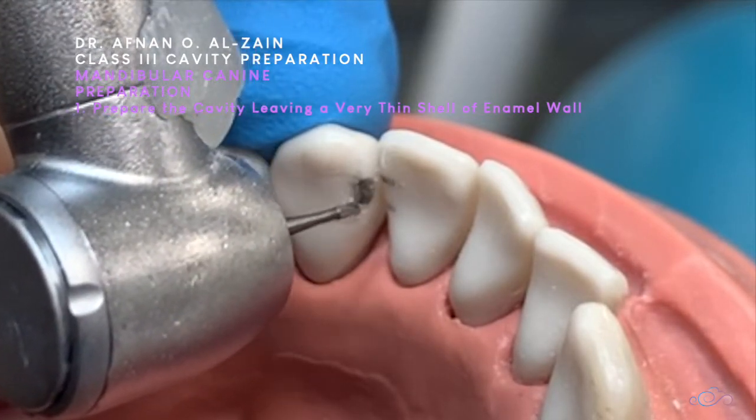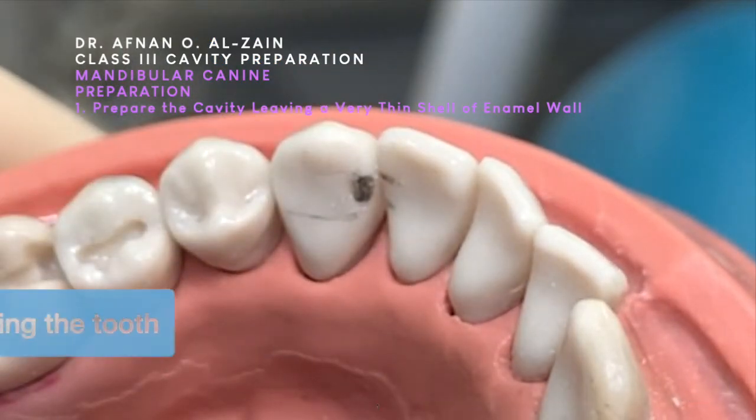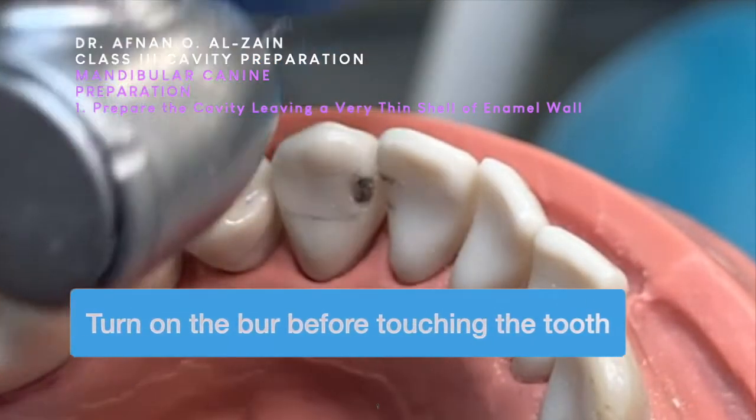We're going to break the contact with the enamel hatchet and the GMT. Now we're going to start preparing the cavity.